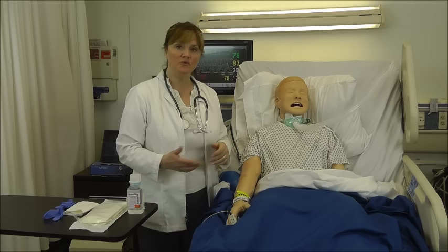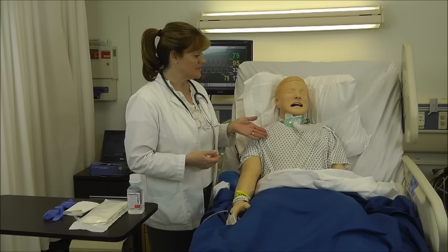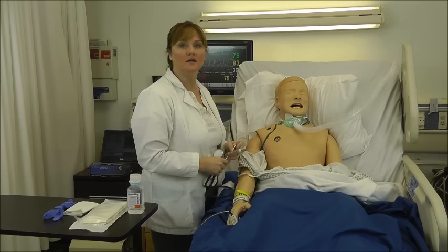Before I begin the procedure, I need to do an assessment, and that includes auscultating lung sounds anteriorly and posteriorly, at least 6 places. Looking at his respiratory rate, his respiratory effort, and his pulse oximetry reading. I'm going to listen to his lung sounds. Mr. Simon, I'm going to lower your gown so I can listen to your lung sounds. When auscultating lung sounds, never listen over clothing or bone.